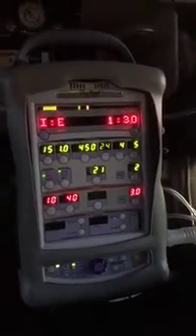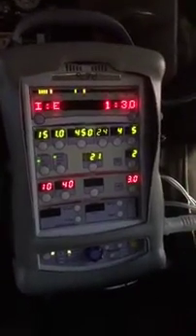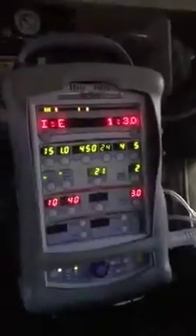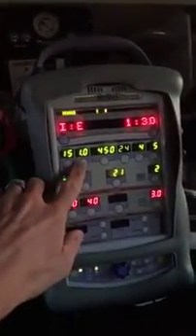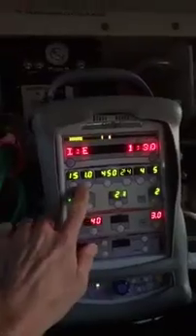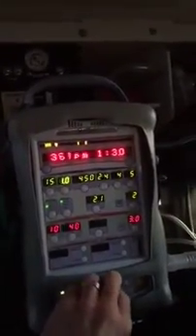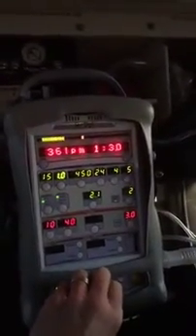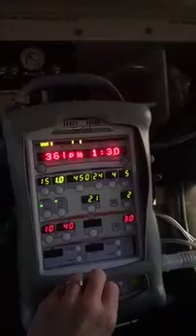How do we change I:E ratios? There are really two primary ways: we either manipulate the respiratory rate, or we manipulate the amount of time the patient is receiving their inhalation — the I-time. This ventilator is great because it will predict for me what the I:E ratio is going to be.